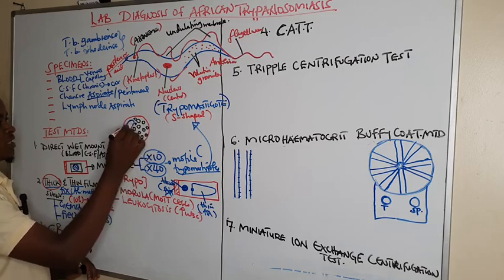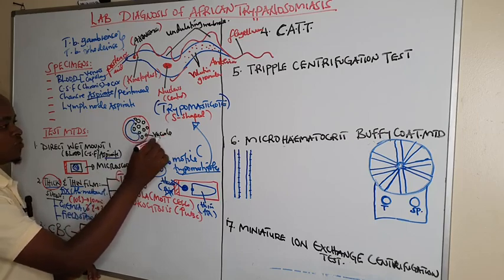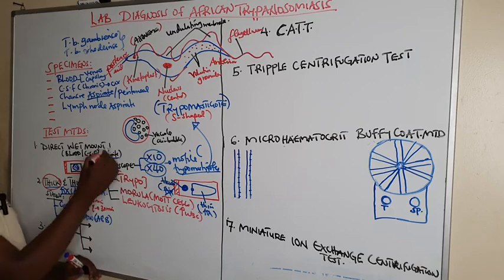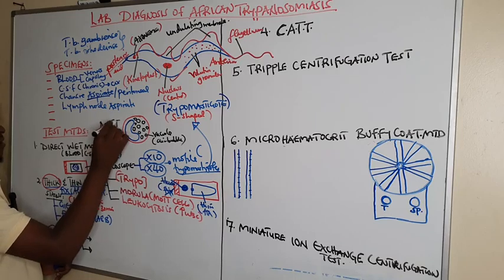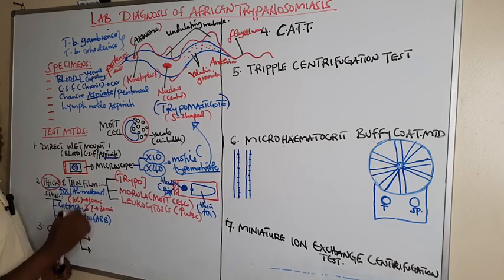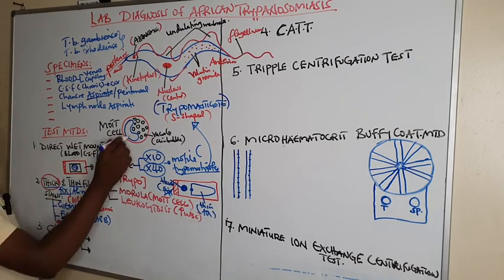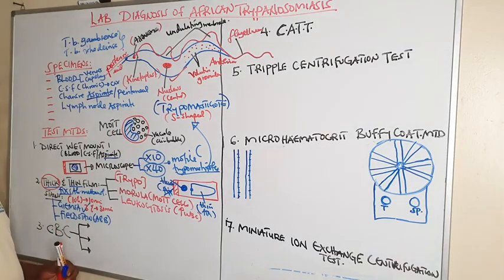These vacuoles look like air bubbles within a white blood cell. So this is what we are calling a Mott cell. A Mott cell, or you can call it a morula cell, also confirms the presence of trypanosomiasis or trypomastigotes.